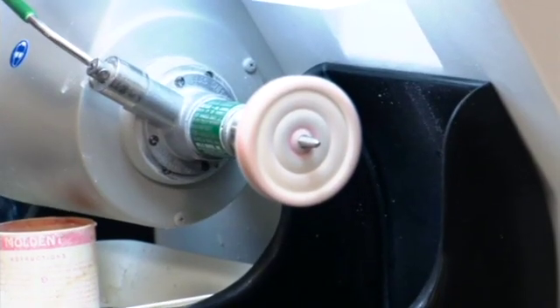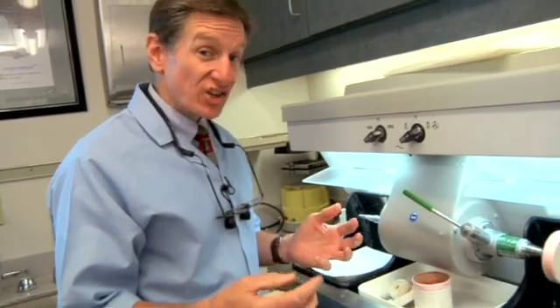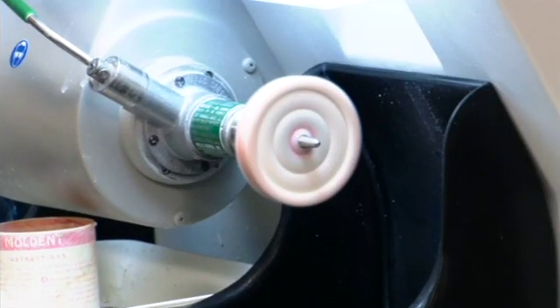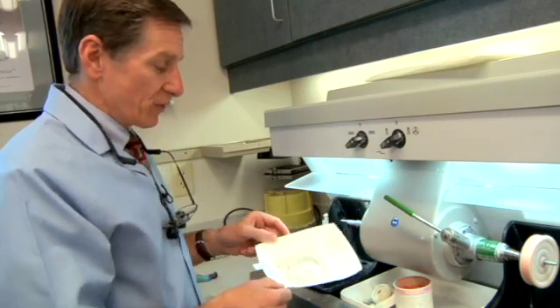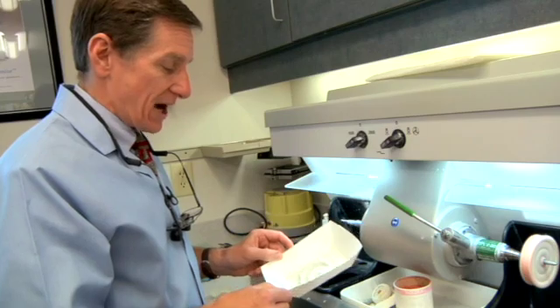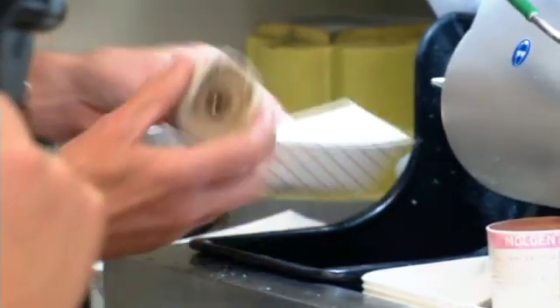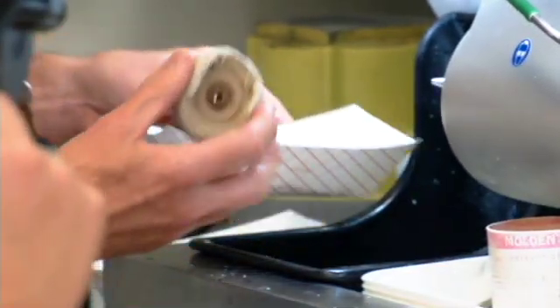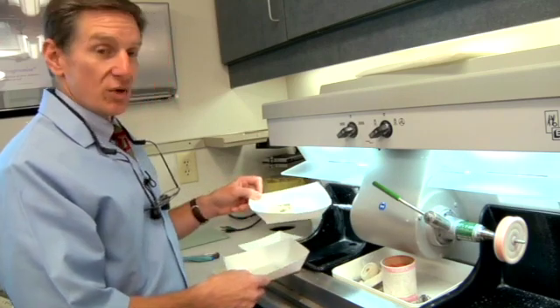One of the things I want to show you about our lathe and the way we keep things clean and sanitary, notice I'm not going to use the term sterile, but we use these little paper containers that you get from the restaurant supply. And we have a little bit of pumice already measured out and stuck in there, and then we run our linen wheels through the autoclave, and then when we get ready to polish something, I just grab one of these. It has a clean linen wheel.